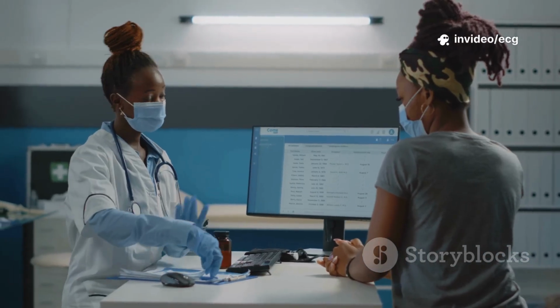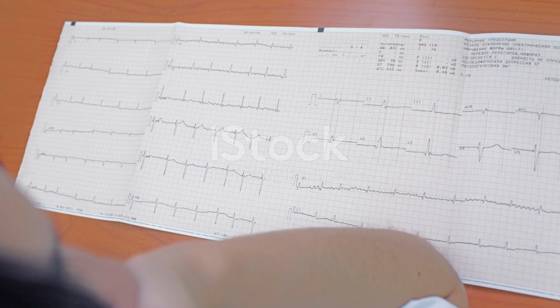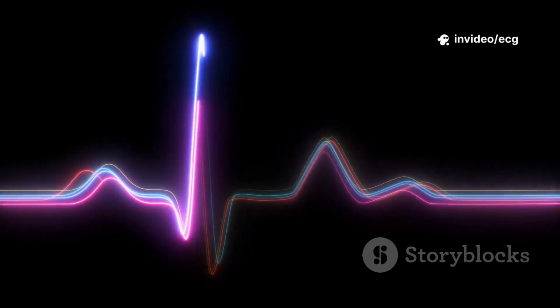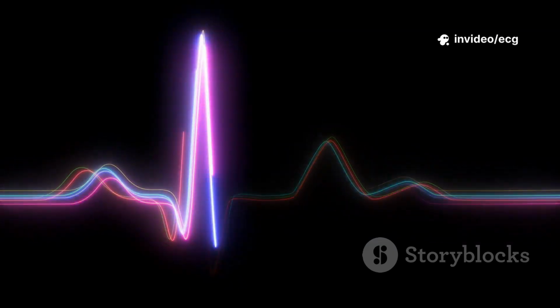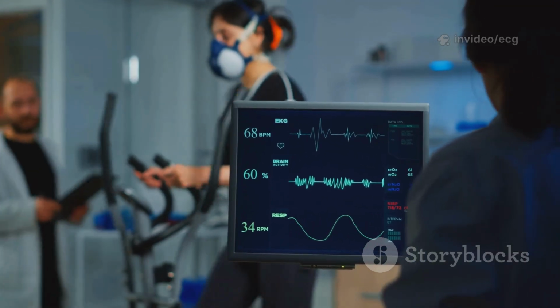Precordial lead V1, fourth intercostal space, right sternal border. Precordial lead V2, fourth intercostal space, left sternal border. Precordial lead V3, between V2 and V4. Precordial lead V4, fifth intercostal space, midclavicular line.